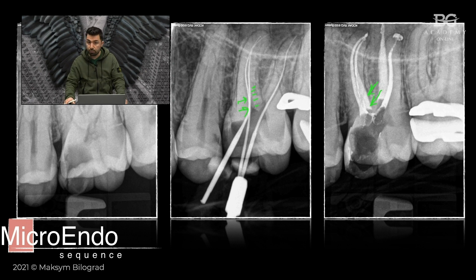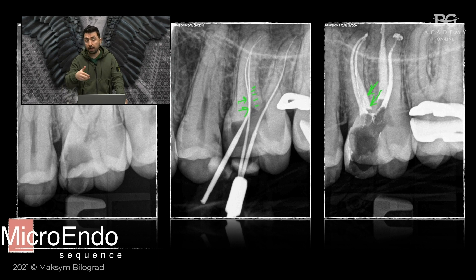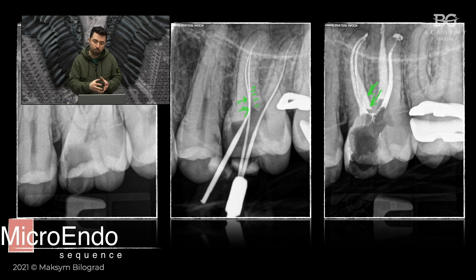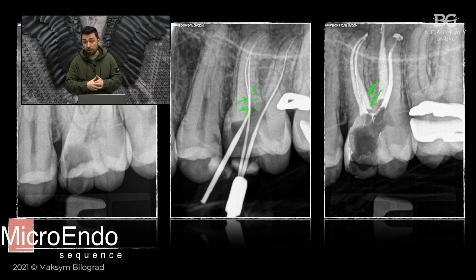How to avoid this: you have to be careful in every single case. You have to analyze what kind of root canal you have and what the difficulty of the root canal is. There is a process called scouting that will help you understand if you need to make your access wider — whether wider in the coronal part or in the upper third of the root canal.